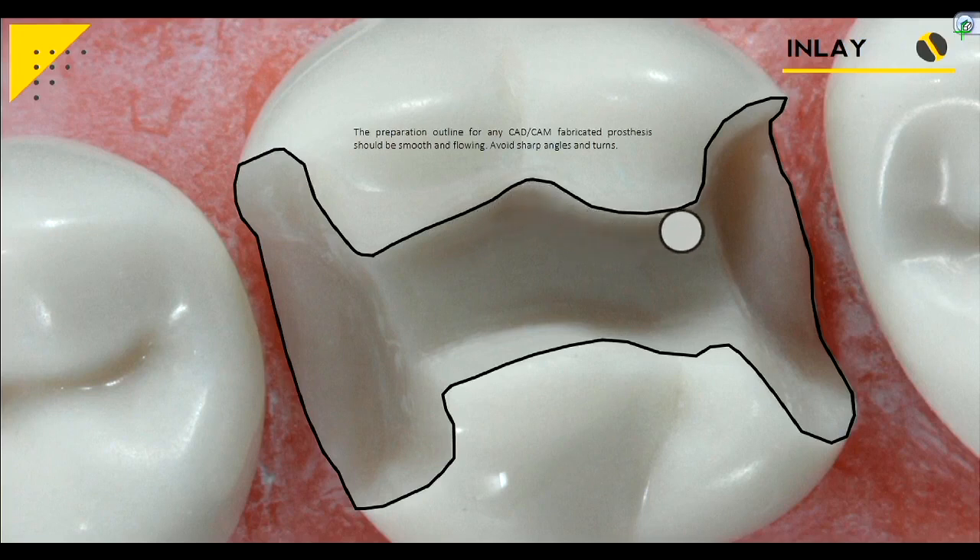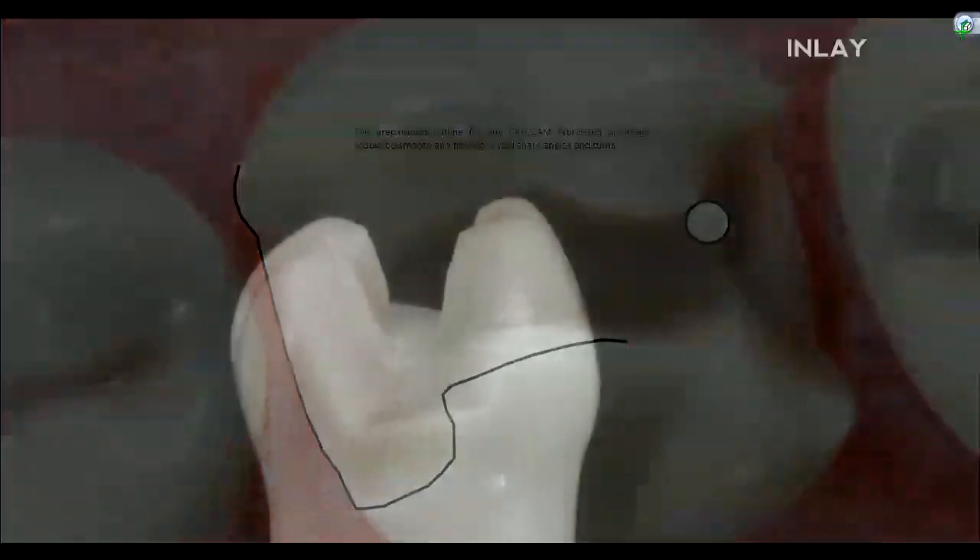It's critical to have your preparation design everywhere be smooth and flowing with no sharp turns and definitely no sharp angles. Visualize the burr and make sure it can get into all those little areas. This principle applies not only to the occlusal reduction but also looking down this view — you want smooth, flowing, rounded corners. Start to develop an eye for when it's too sharp and where you have to round out.